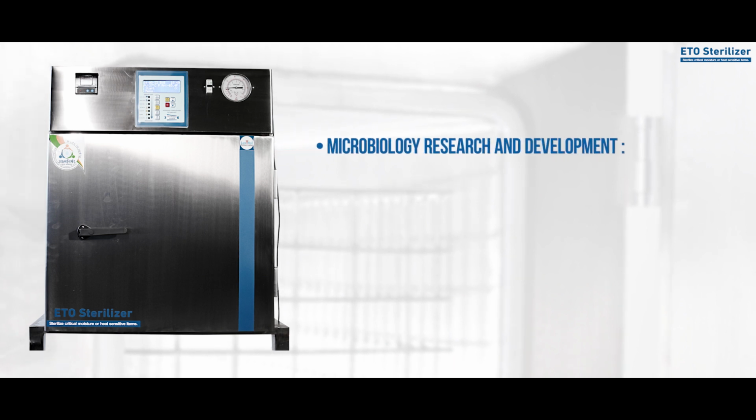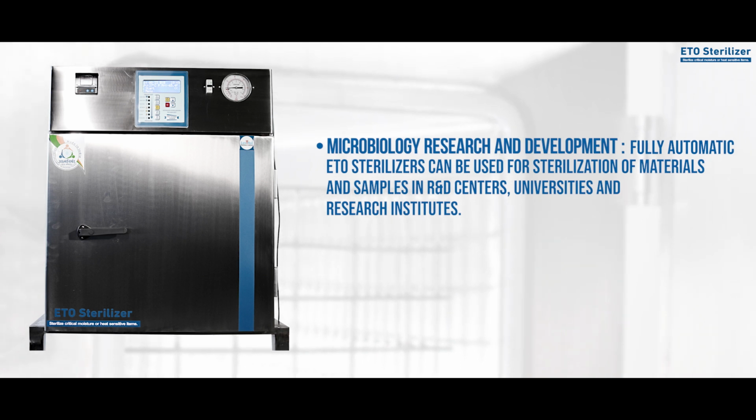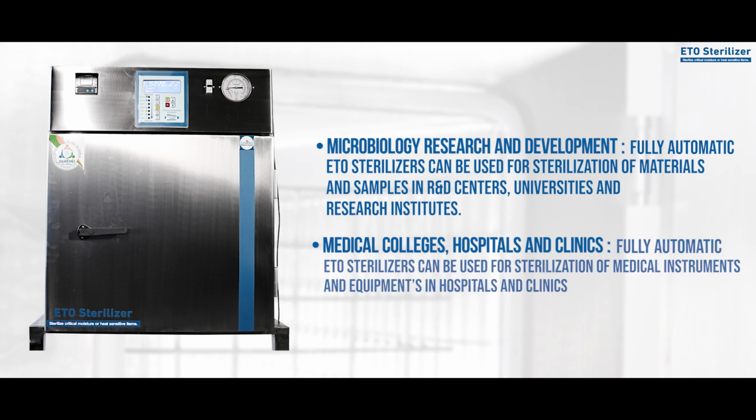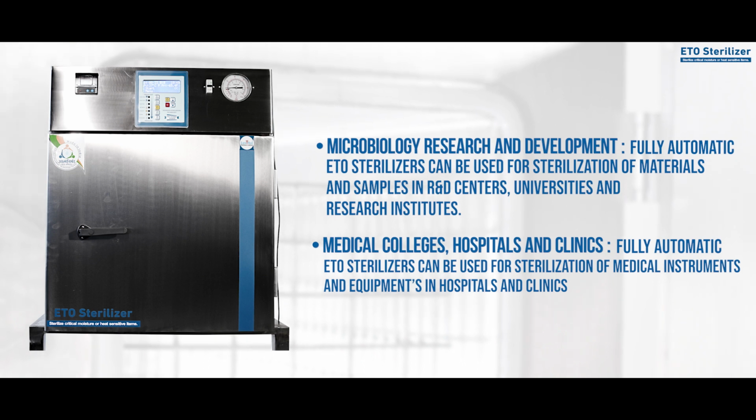Microbiology research and development. Fully automatic ETO sterilizers can be used for sterilization of materials and samples in R&D centers, universities and research institutes. Medical colleges, hospitals and clinics. Fully automatic ETO sterilizers can be used for sterilization of medical instruments and equipment in hospitals and clinics.